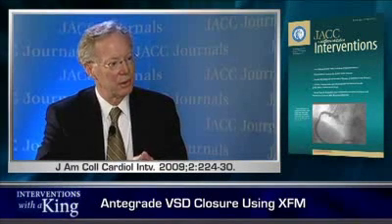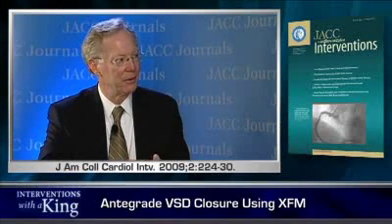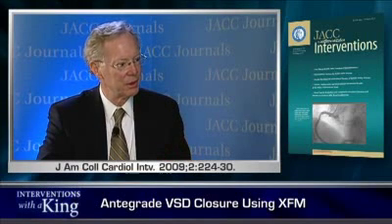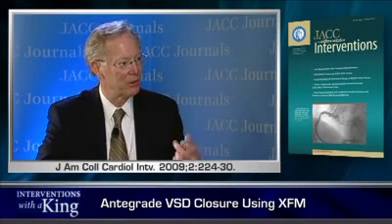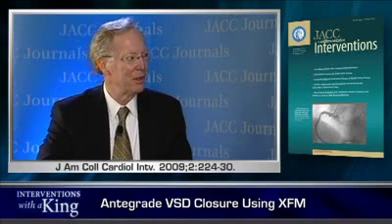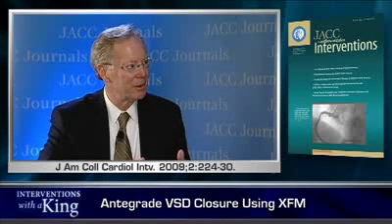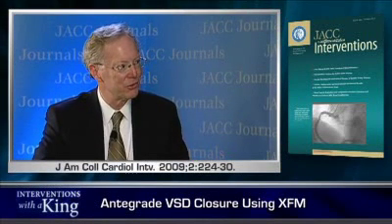So this is an offline MRI, and then you get in the cath lab and you register this, and with that you can, and I think you will see from the article the images showing how this works, and actually nice online images which will be published in the online version of the journal. Tell me, is there going to be in the future a way to use MR online, real time, to help us guide three-dimensional navigation for structural heart disease?